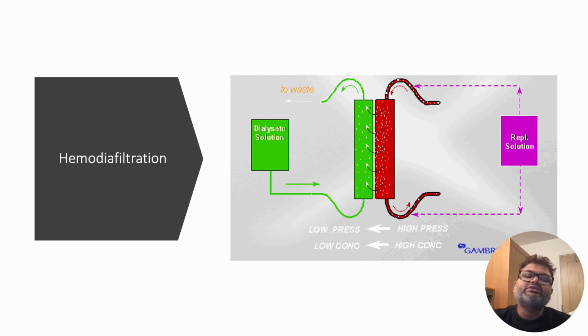Here we put some replacement fluid before or after the filter, depending on whether we are using pre-filter or post-filter. We'll discuss later what the pre-filter and post-filter are.